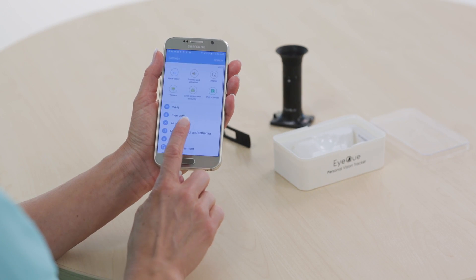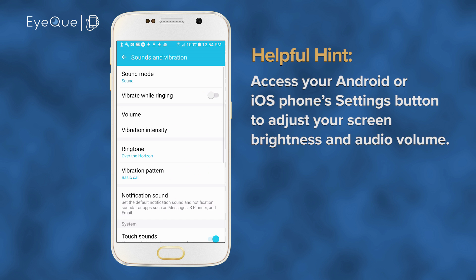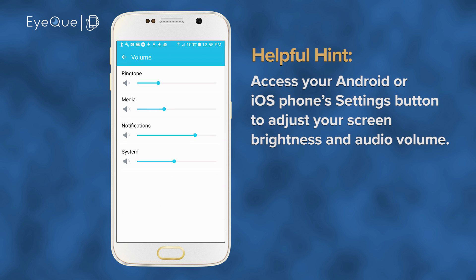Before you launch the MyIQ app, it's important to check that your smartphone's screen brightness is set to maximum, and the audio controls are turned up to a comfortable listening level.